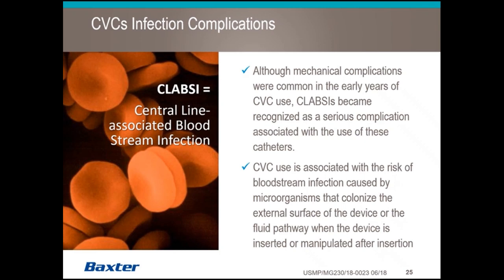So it's just important to remember that you will be accessing your patient's central line frequently during CRRT therapy, and every single time that line is accessed, it presents a risk for CLABSI. So make sure that you're following very carefully your hospital's policies and protocols for central line dressing changes, accessing catheters, the protective equipment, the PPE that you wear during a central line dressing change or accessing a catheter, your proper procedures for disinfecting, aseptic technique. But it's also very important to remember your patient at this time as well.